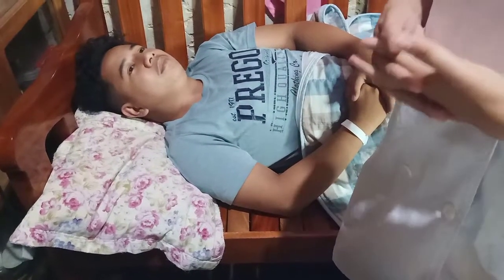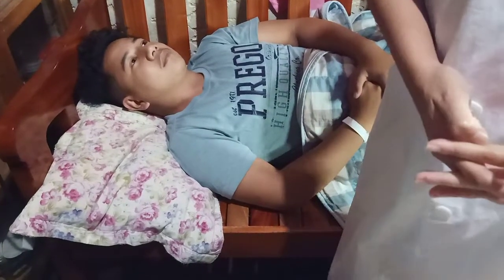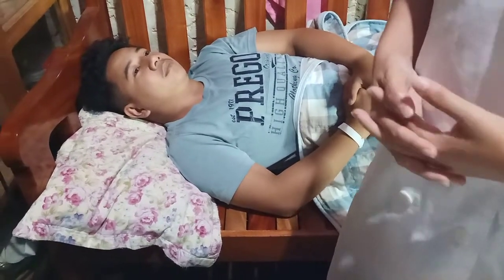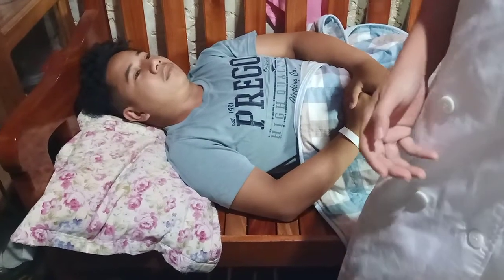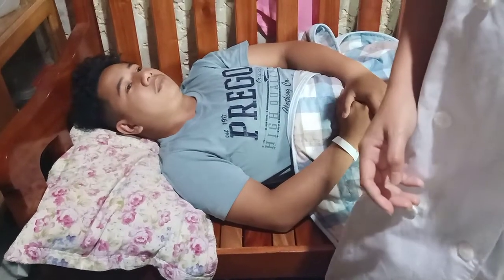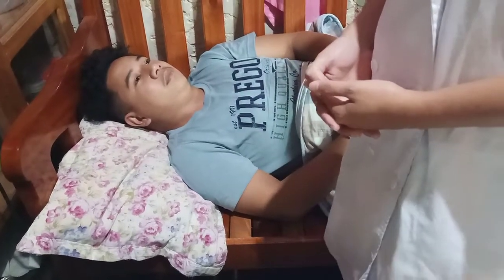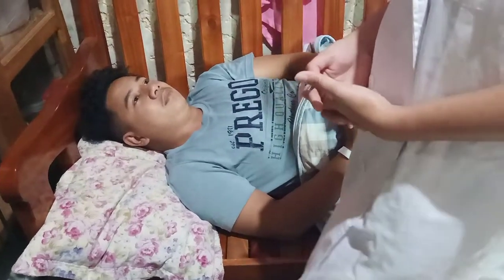And now choose the injection site free of lesion or discoloration. Select the site 3 to 4 finger widths below the antecubital space and 1 above the wrist. Position the client's arm so that his elbow and forearm are supported on a flat surface, then apply clean gloves.